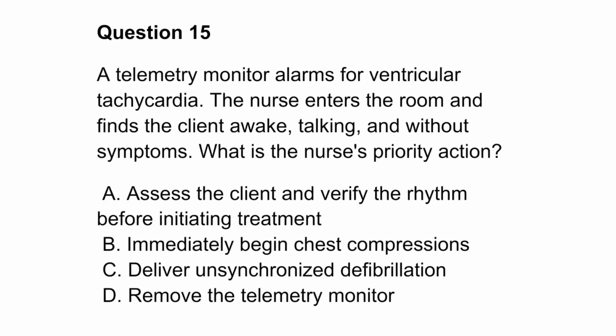Question 15. A telemetry monitor alarms for ventricular tachycardia. The nurse enters the room and finds the client awake, talking, and without symptoms. What is the nurse's priority action?